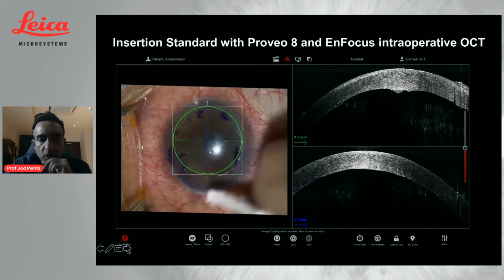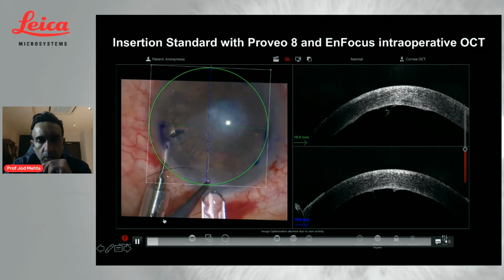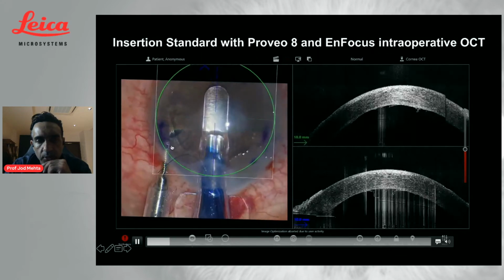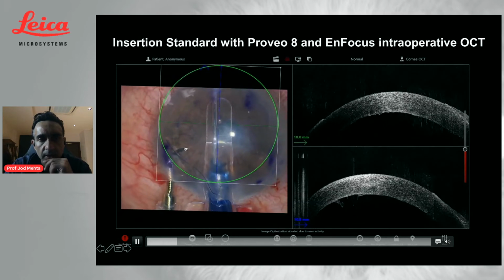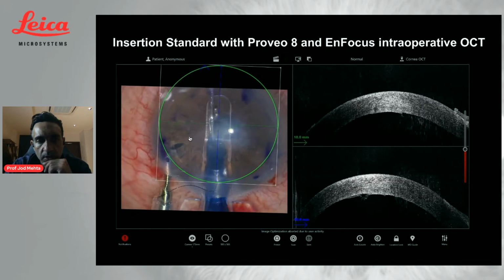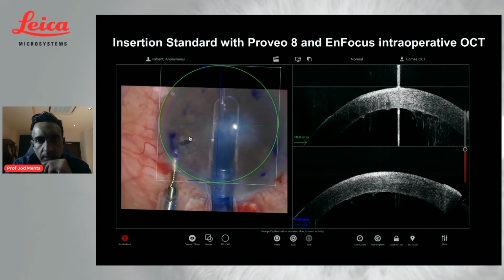So the graft insertion is done through a 2.6mm incision. This is quite simple. You put it inside the eye, and normally have a pre-placed suture, inferior PI, and this is a double port AC maintainer. You can see the fluid is coming out from the edges of the AC maintainer, not the front side. And then you come across with 27 gauge forceps. You can grab the tissue and you can pull this inside the eye itself. Okay, so on the OCT, you'll see the graft coming in.